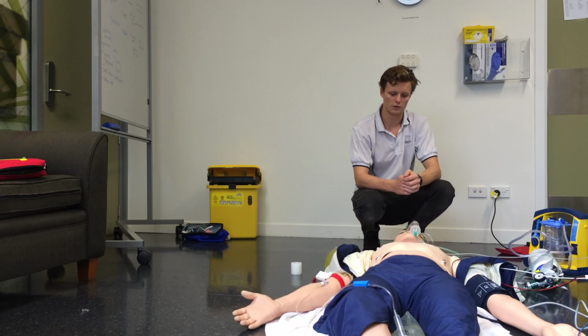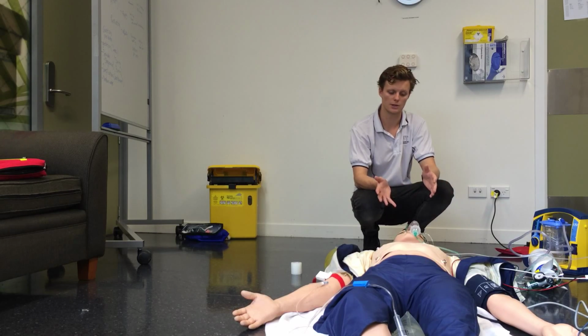So what he could do in that case, I'm going to take over manual ventilation while he prepares to have another go at intubation, where he changes something. Something has to be changed, whether that's the size of the ETT tube or not, and then he'll have another go. If that fails, we'll take over and we'll just do an LMA or an alternative airway device. And if that fails, we might even look at cricothyroidotomy, which I will help assist with as well. Sweet.